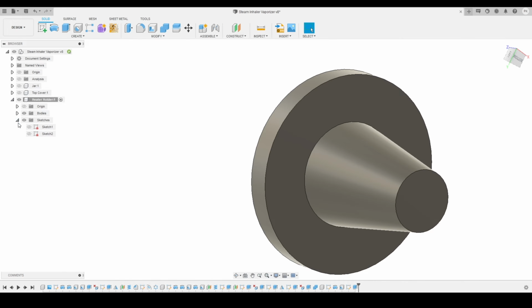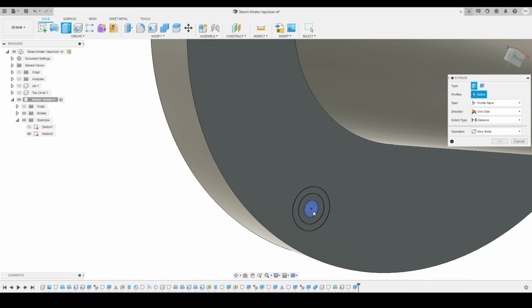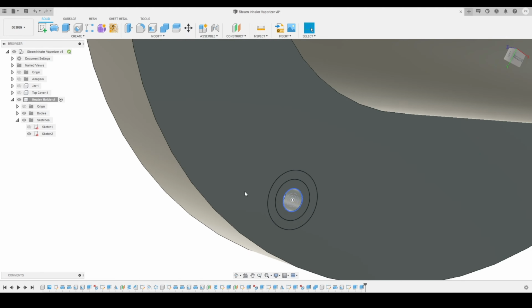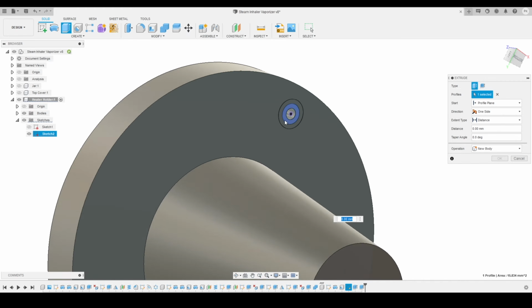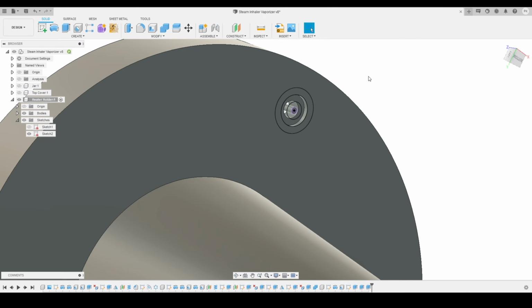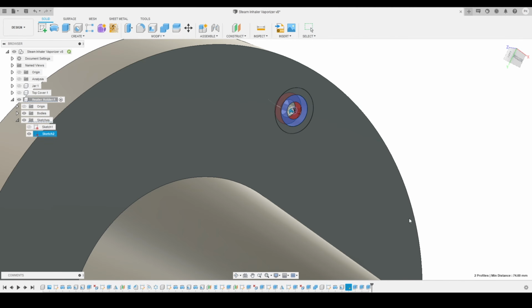I will turn our sketch on again, and I will activate my extrude tool, and now I select these internal circles and will make it cut like this. So here you can see what kind of shape we got. Before that I will just extrude these portions on the other side, so it will give it a little bit of strength. So here you can see I just created a recess for the screws, so whenever you are putting in a screw over here, it will not be visible on the surface. That's why I created a recess over here. And here is our result.